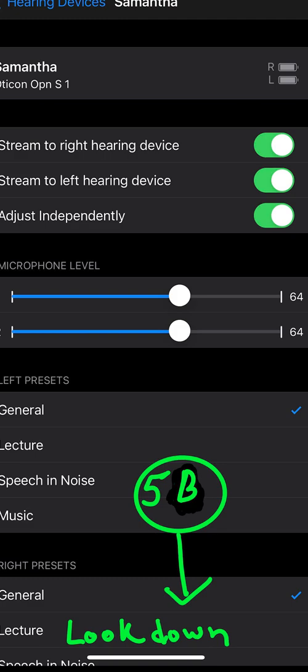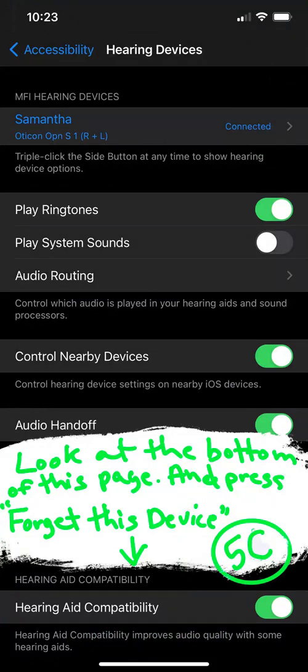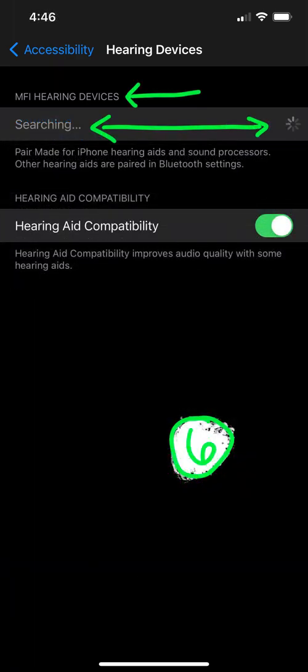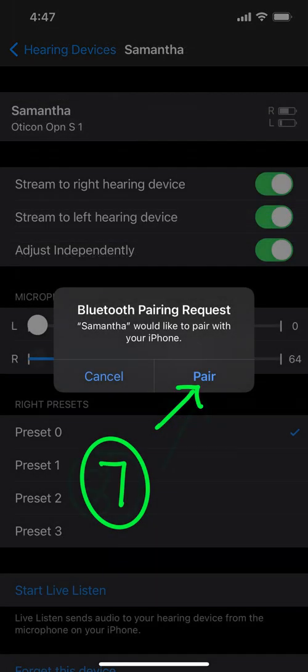In five B, look down to the bottom. If you needed to unpair your devices, this is where you would do that — at the bottom of that screen it would say 'Forget Devices.' But we're going to go to number six and search for hearing devices.